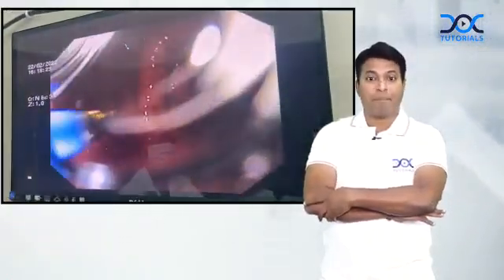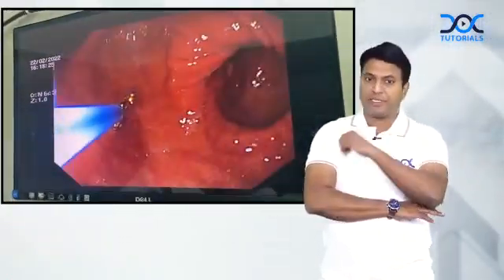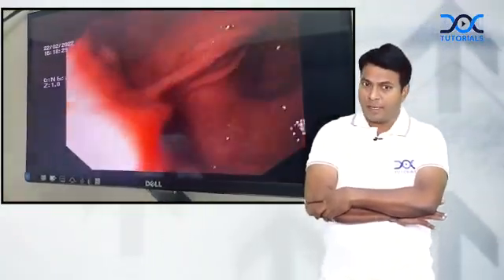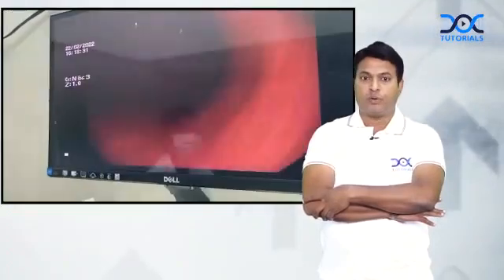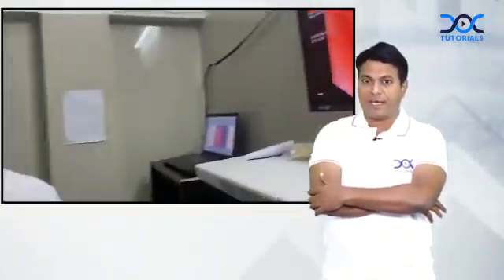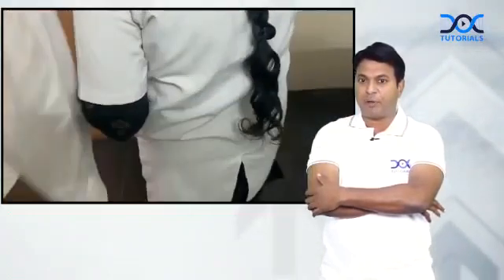That punch will be sent for a rapid urease test. The tissue is taken out now, and the assistant is going to take that tissue. She is taking the tissue and doing a test in a rapid urease kit — you can see that is a rapid urease kit.